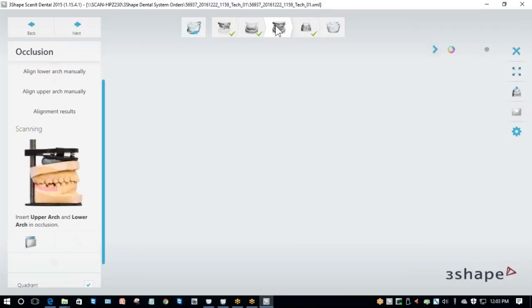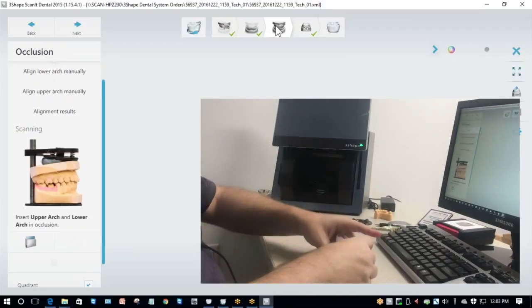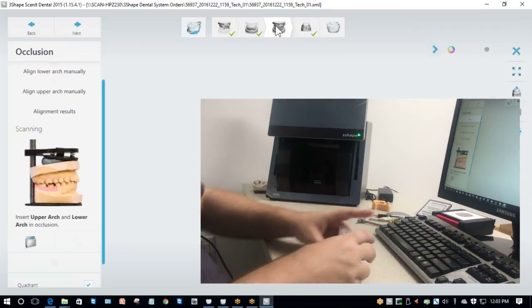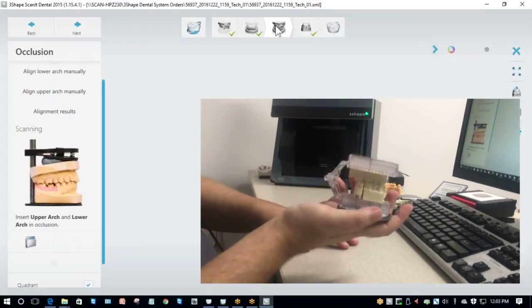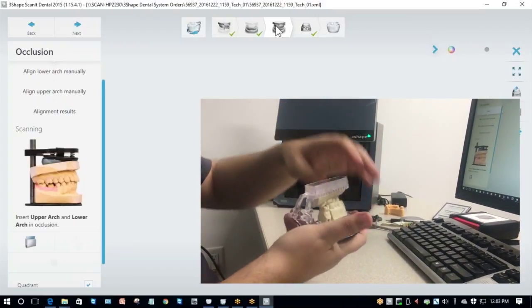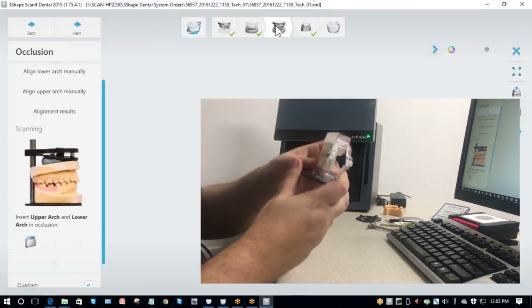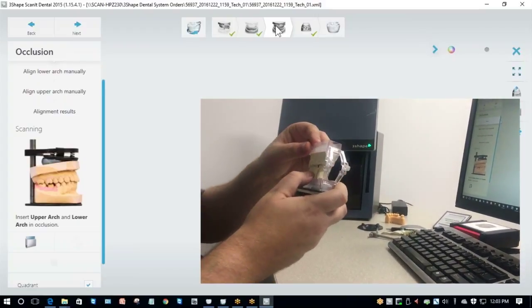Now that I have that, I need to do my bite scan. I can either click Next or click on the icon up here in the center to switch between steps. For the bite scan step, you want to articulate your model back together and place it on the scan plate, again buccal side facing the round side, and load it back up.